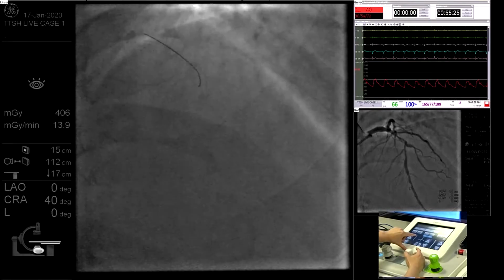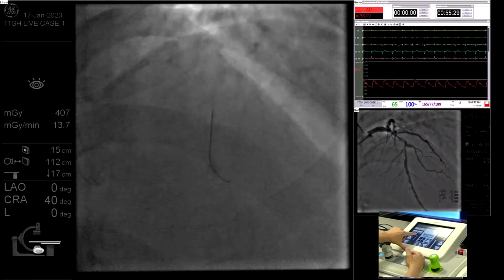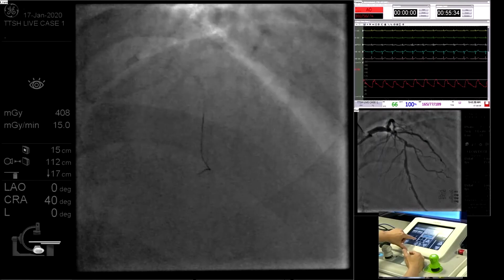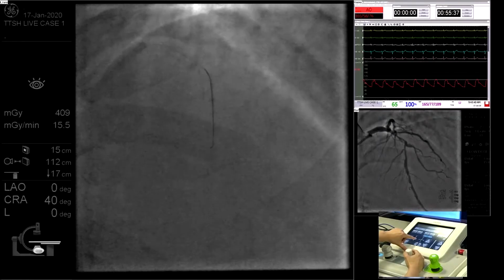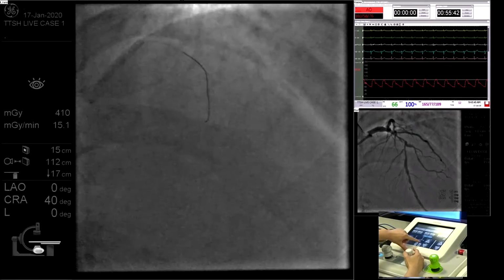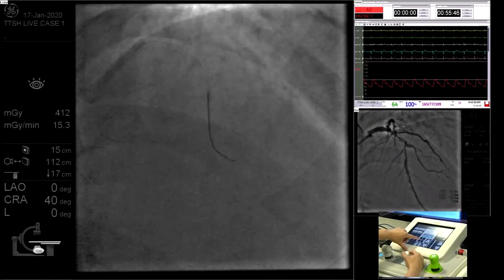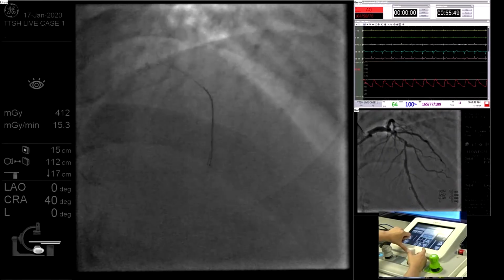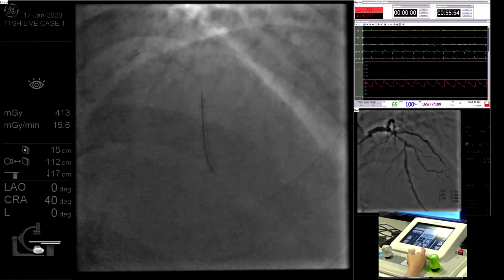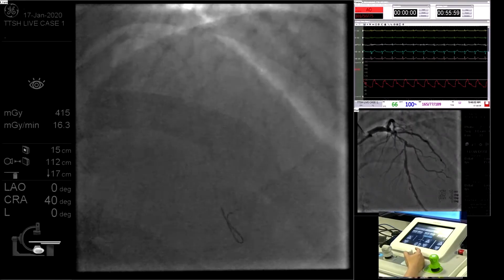Last year I kind of half joked that I can probably have some of the wiring gurus. Like, I really enjoy what Paul Carr was doing, he's a Chen Foundation award person, so I like the way he wires CTO. In theory, at a given time, I can learn his technique with the robot and do it this way too. I'm hoping to get this wire down, and then I'm going to put the IVUS down and IVUS this vessel. This wire has gone down okay.